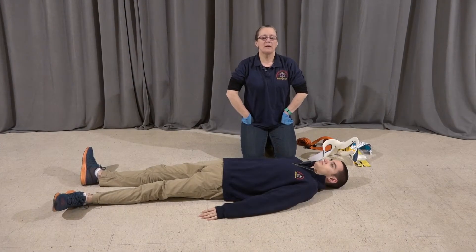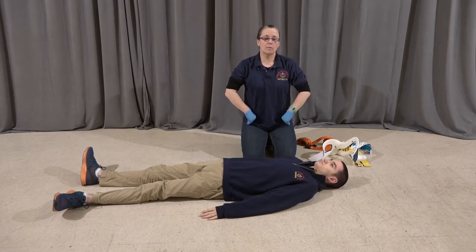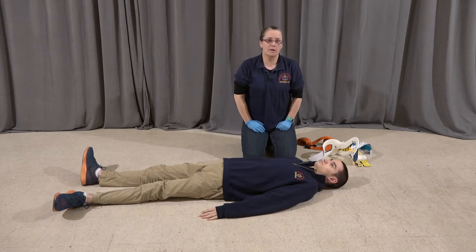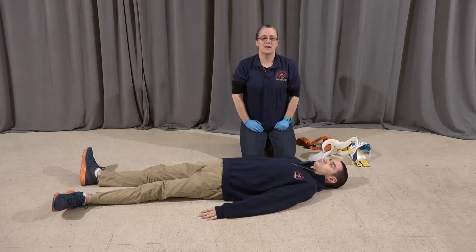This is a demonstration of mobilization of a patient onto a longboard. We're going to start with BSI, ensuring that the scene is safe. And I'm going to have my partner come in and take inline stabilization of the patient's head.